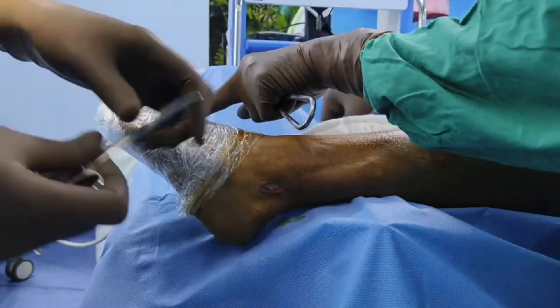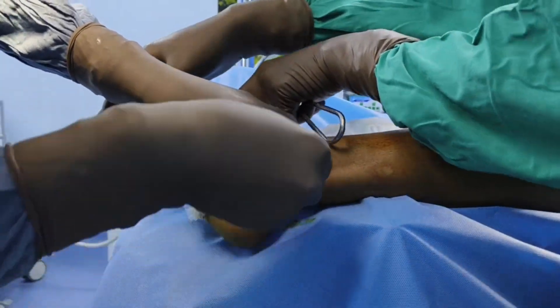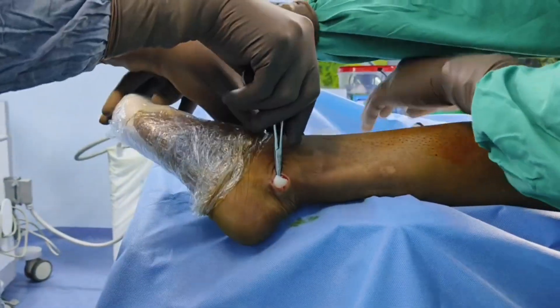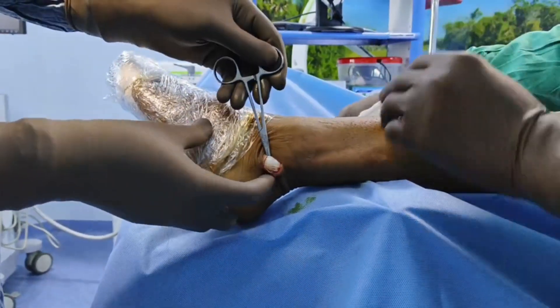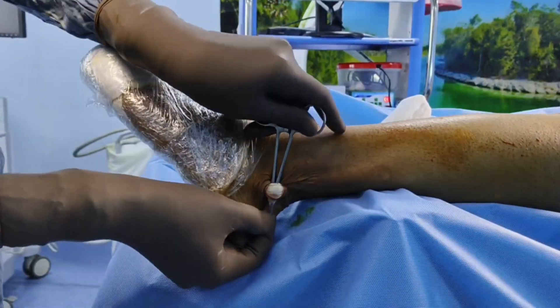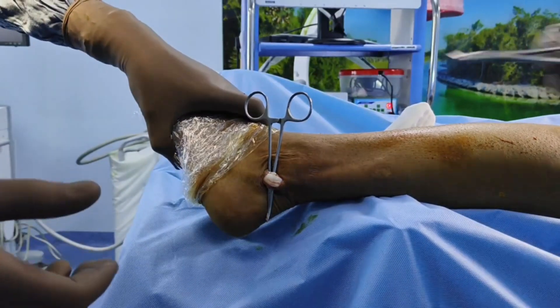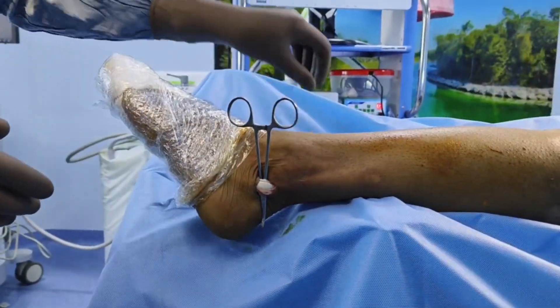Once the retinaculum is incised, use a hemostat — that is artery forceps — and use it to deliver the two tendons out of the wound. There are two tendons in the artery forceps: one is the peroneus longus and the other is peroneus brevis.